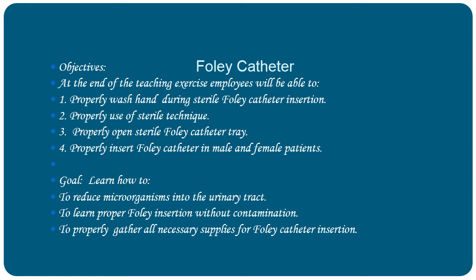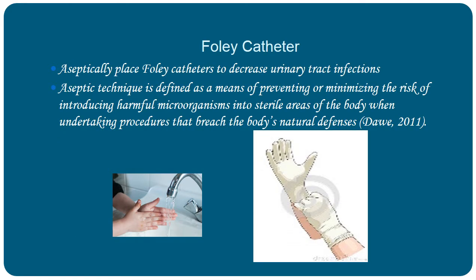Aseptically placing Foley catheters to decrease urinary tract infection is the top priority. Aseptic technique is defined as a means of preventing or minimizing the risk of introducing harmful microorganisms into sterile areas of the body when undertaking procedures that breach the body's natural defense.